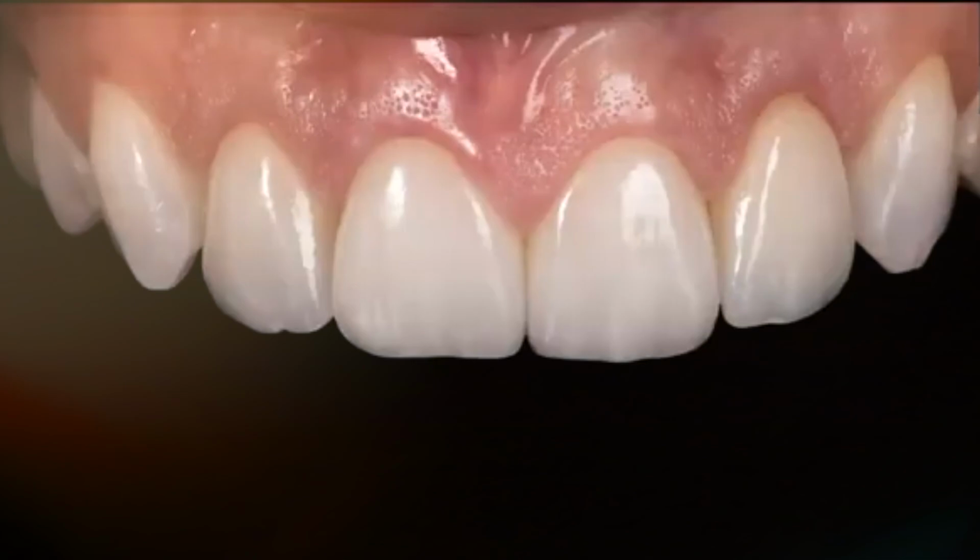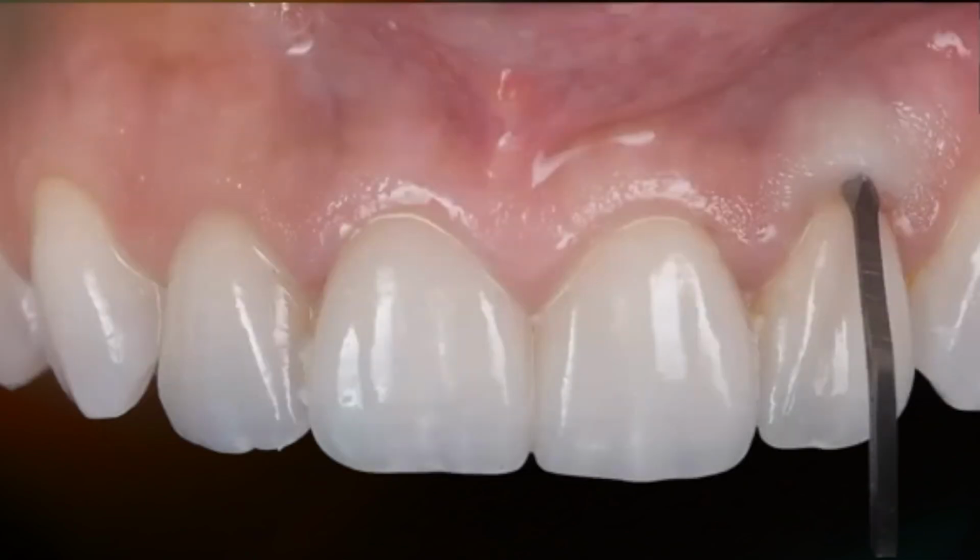When you stain inside, the stains are metal oxides, so technically speaking, you will lose adhesion. However, if you glaze on top of that, you regain adhesion, which means when you design this type of restoration and you know you're going to stain inside, you should increase the cement gap, not the margin gap, but the cement gap of the restoration. Otherwise, you'll have trouble adapting them.